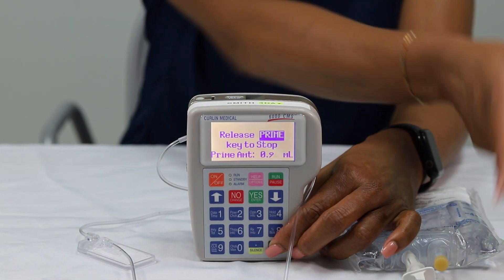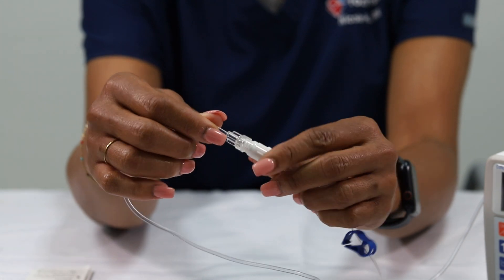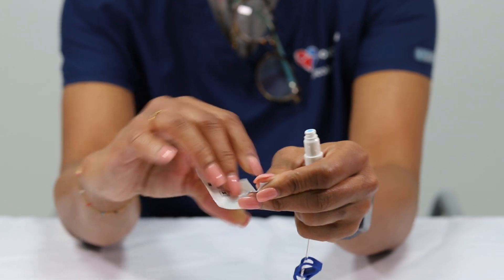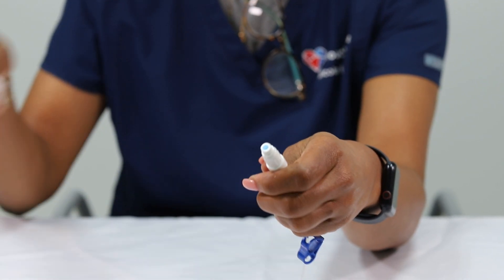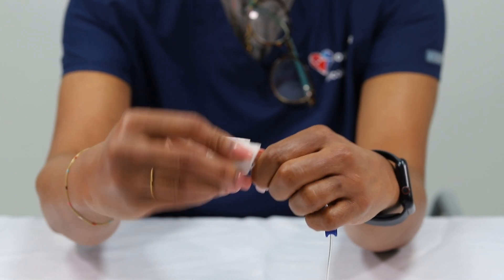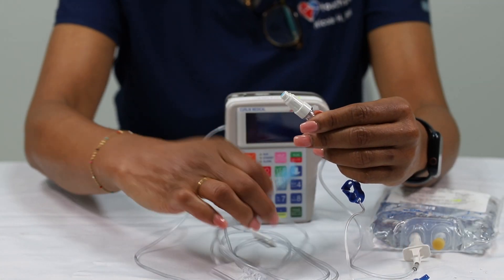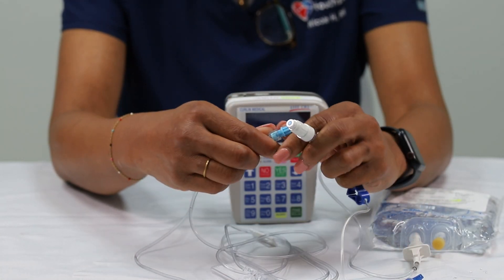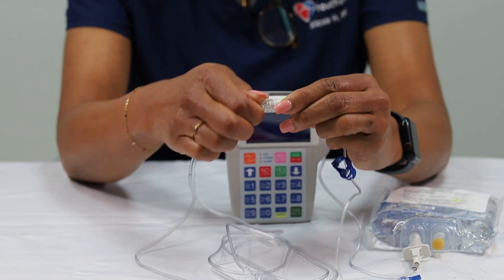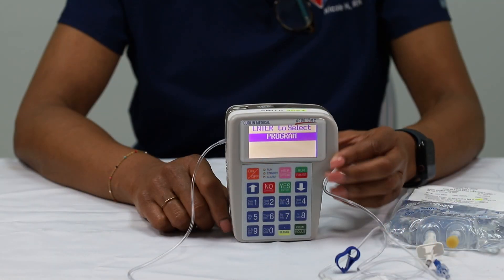Now you are ready to connect your new IV medication bag to your IV line. Disconnect your old medication bag line. Wipe your IV line with an alcohol wipe for at least 15 seconds. Connect the new medication bag to your IV line.